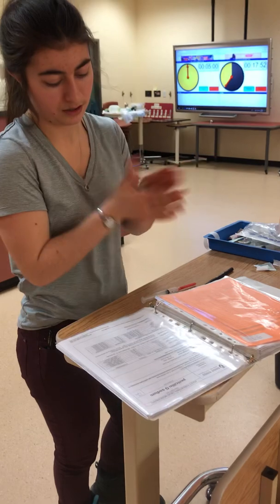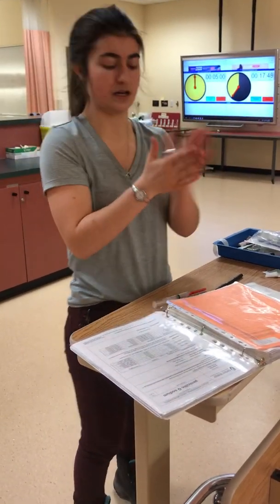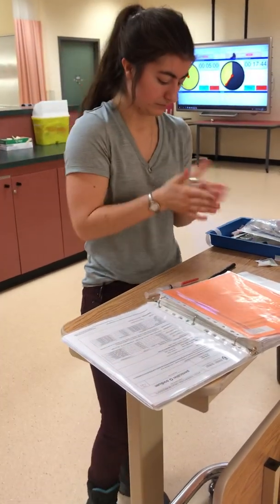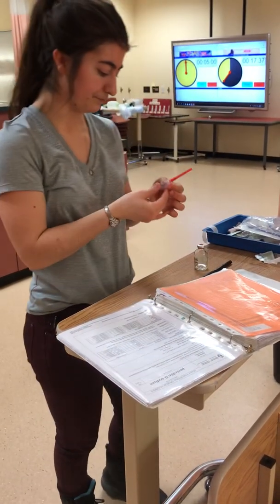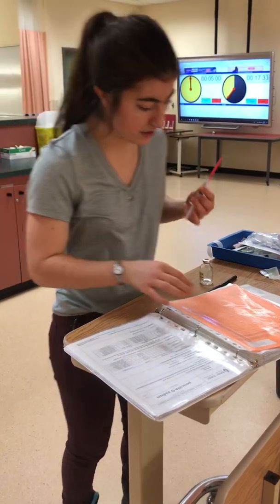I'm going to make sure that everything in here is shaken up and I have an even distribution. Alright, that looks good to me. I'm going to take a new swab, clean for 30 seconds, let dry. Now I'm not taking 3.1.